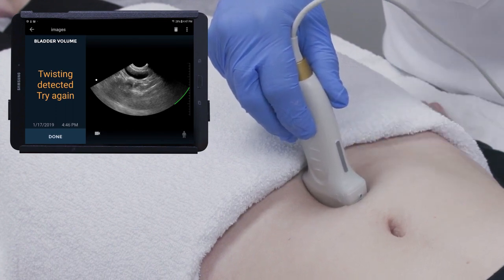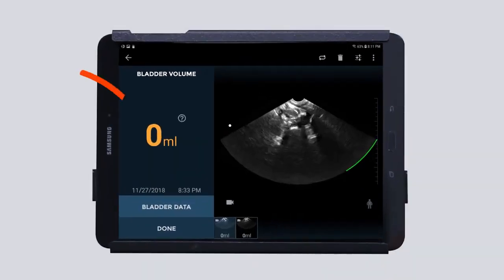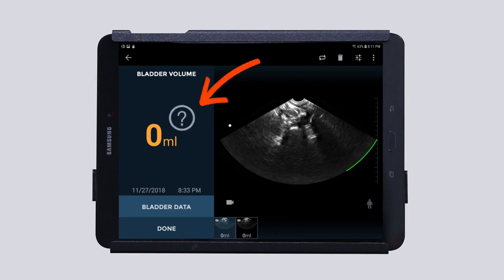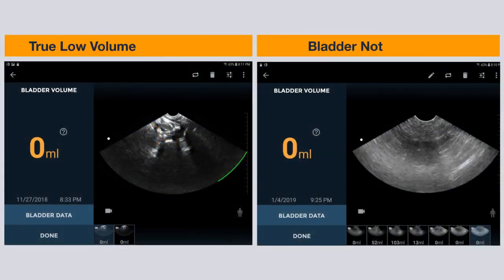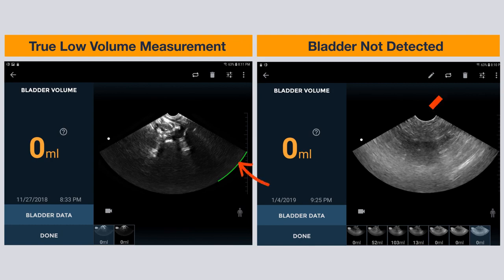Lastly, if a zero milliliter reading is obtained, tap the question mark icon. A message indicating possible reasons for an empty result will appear. Note: a true low volume bladder scan will present with a clear pubic bone indicator and a clear visualization of a small empty bladder on the screen.